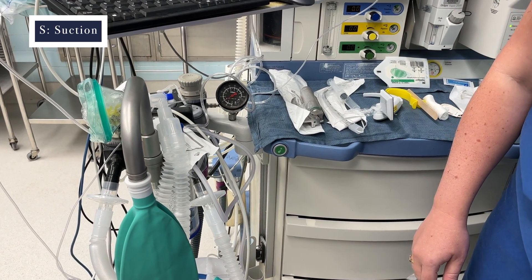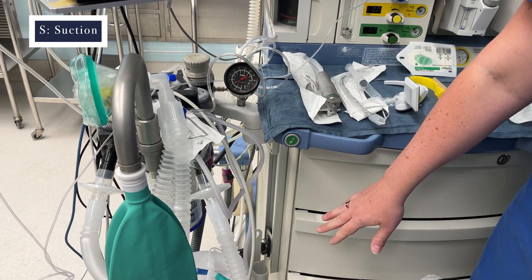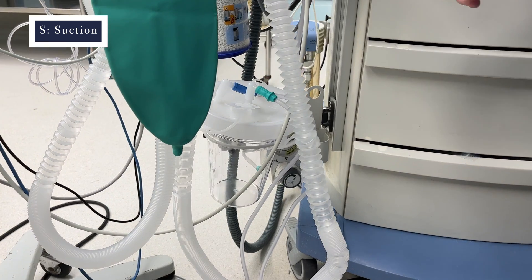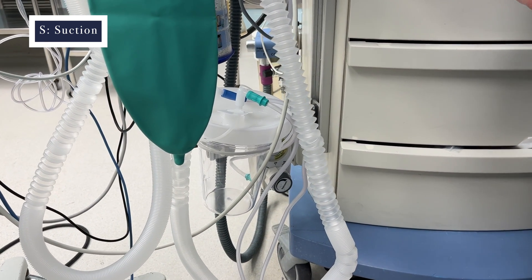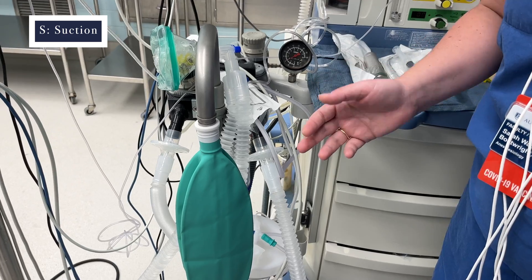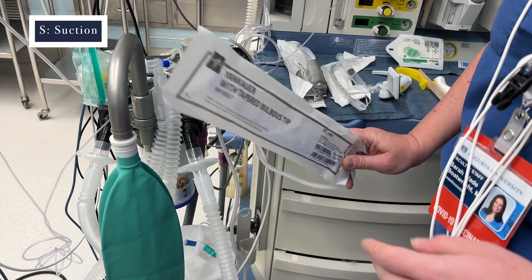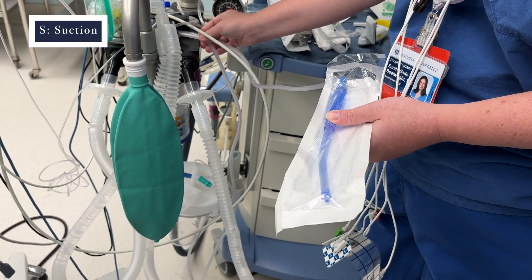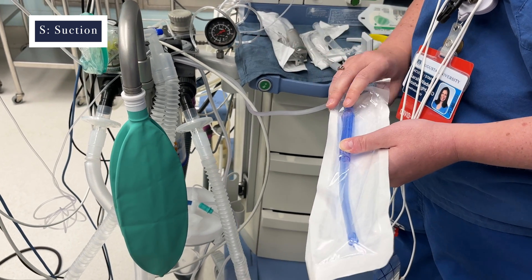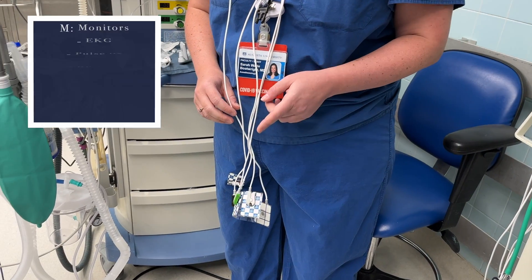Our next letter in MSMAIDS is S for suction. That's pretty straightforward — we have our suction canister here and our vacuum dial at the bottom. I always have mine turned on so it's always available, because when you need it you usually need it right away. I have it connected to a Yankauer tip and wedge the tubing in so the noise stays quiet while I'm not using it.